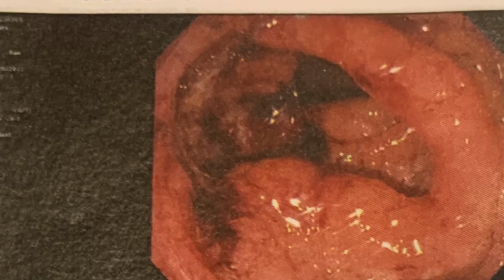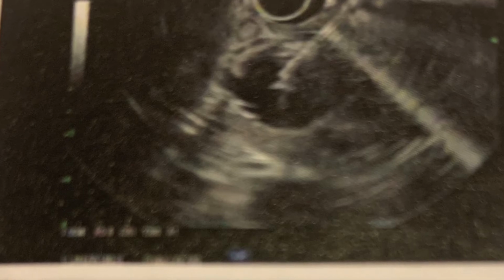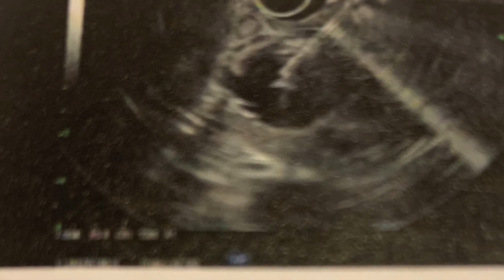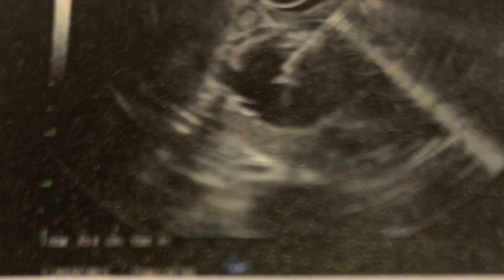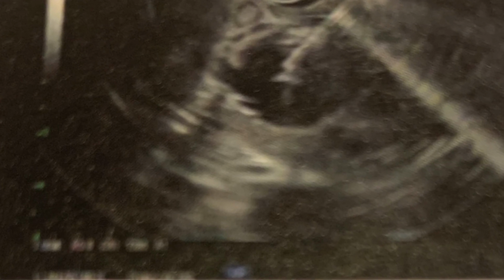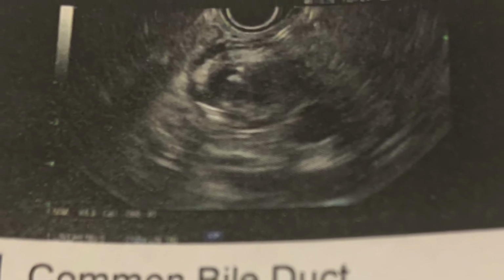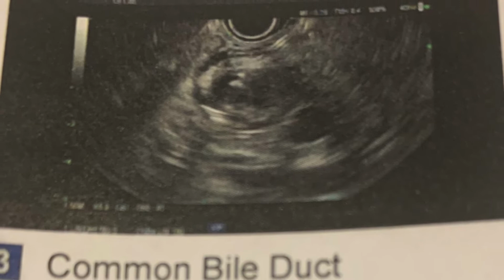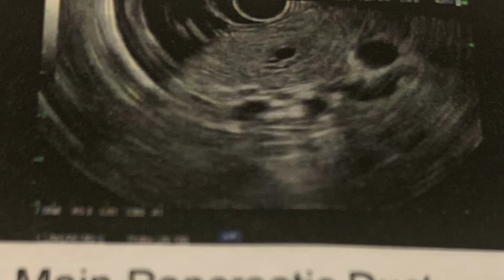A case of severely deforming ampullary carcinoma, precluding free cannulation of the common bile duct. EUS rendezvous approach with access to the dilated common bile duct using a 19-gauge needle. A monofilament guide wire was inserted into the common bile duct.